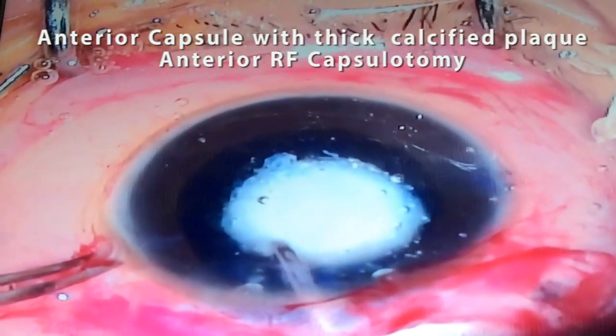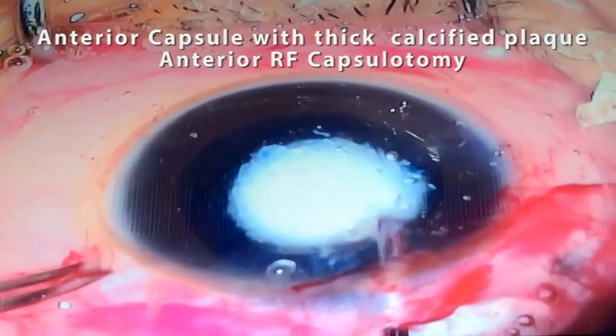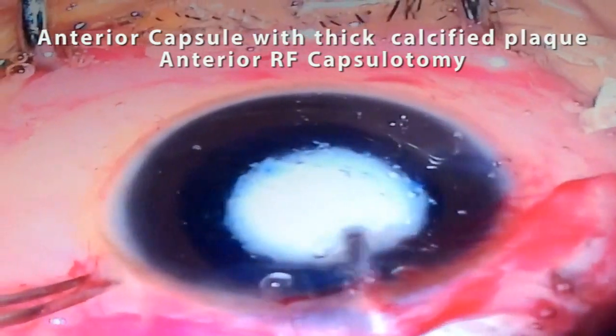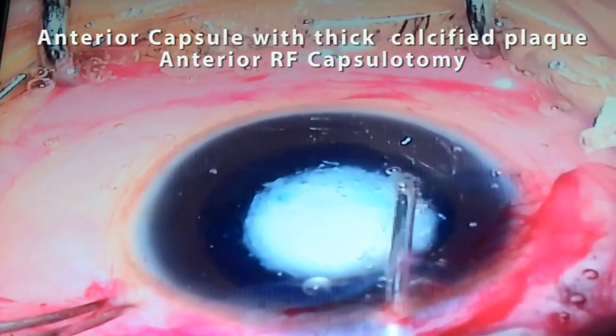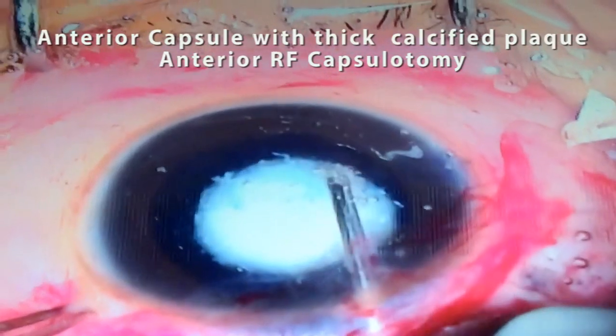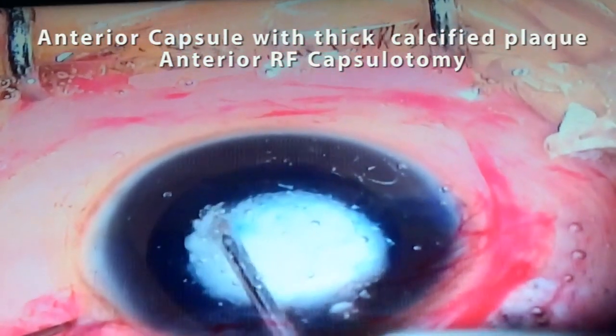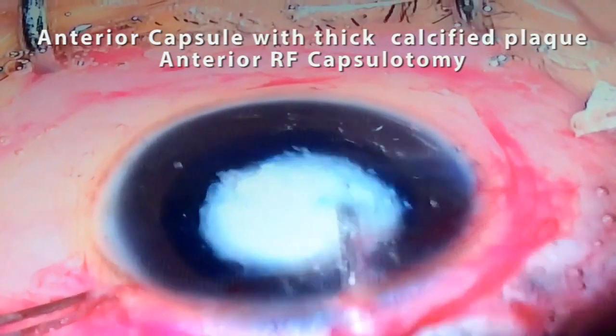Before performing RF capsulotomy, the anterior segment is filled with a viscoelastic substance. The probe tip is firmly placed in contact with the anterior capsule and moved at a steady rate in a circular path, depending upon the size of capsulotomy needed, to create a round opening.